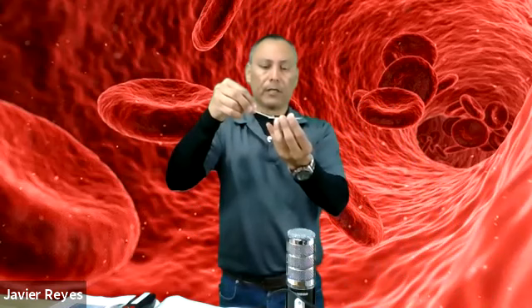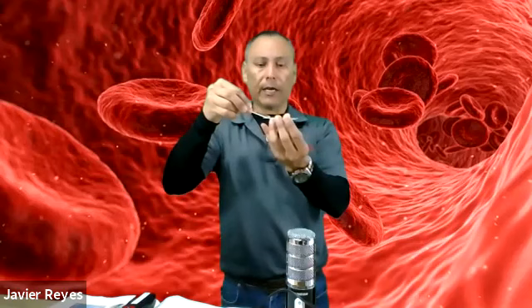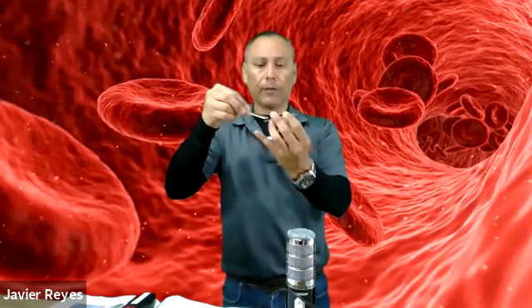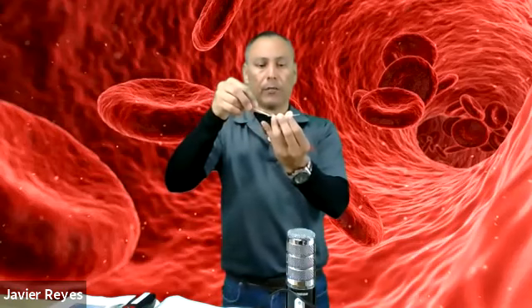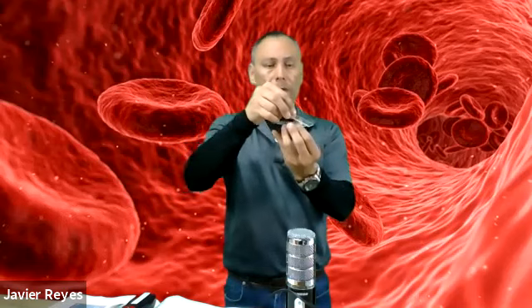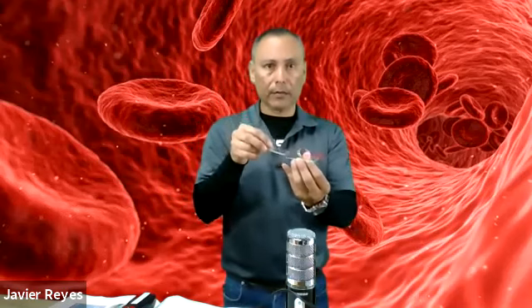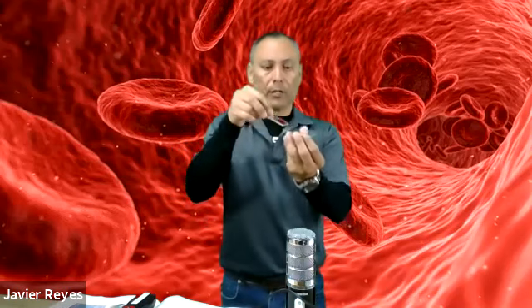Now, when the second slide makes contact with the blood, it is going to run side to side. It's going to run from here to here. And at this point, with one motion, you're supposed to push forward, right? And make what we call a feathered edge smear, okay? It is not an easy task. It takes practice, okay? So this is what you use.